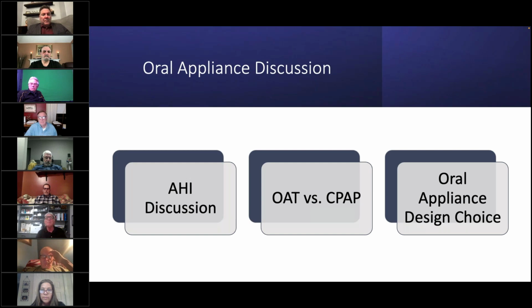At the same time, there are other factors that we look at to help determine what step we're going to take. The one thing I think about when I think about advanced or connected appliances is that I'm more comfortable with a connected appliance when I'm looking to eliminate all the possible complications and all the possible issues that may make this case worse. I tend to go to a connected appliance.